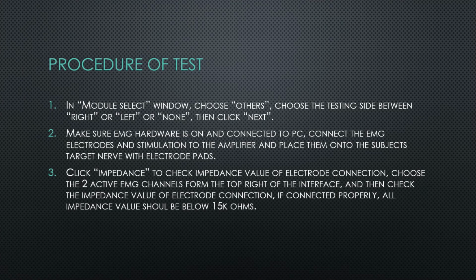Procedure of the test. During the test, the subject sat in a comfortable armchair and was relaxed but not asleep. The room temperature was maintained at 24 plus or minus 0.5 degrees Celsius. Skin temperature of the examined limbs remained unchanged, 33 plus or minus 0.5 degrees Celsius, all over the time of the test. This protocol was followed because temperature is known to affect conduction velocity of unmyelinated sympathetic fibers.